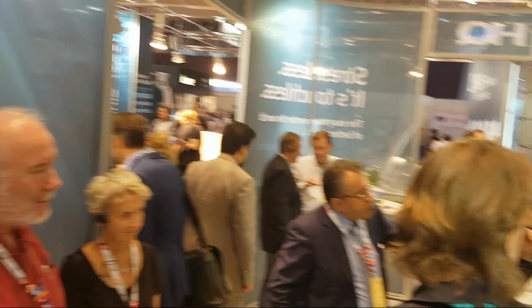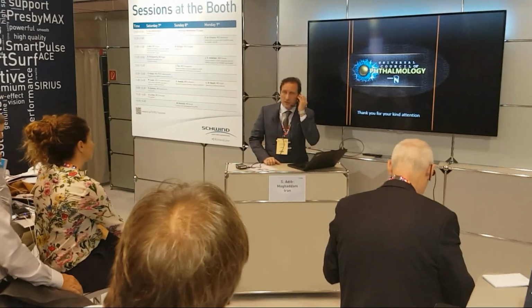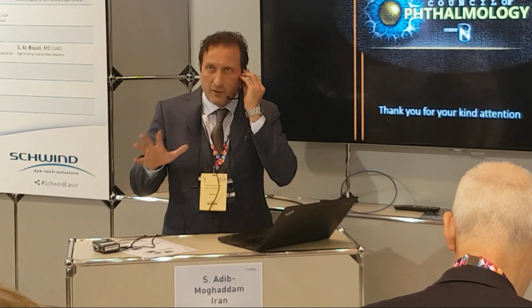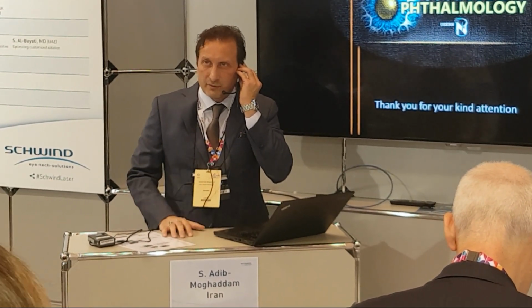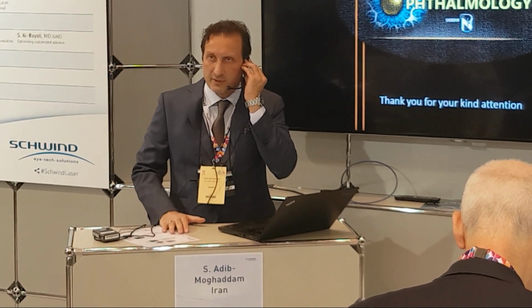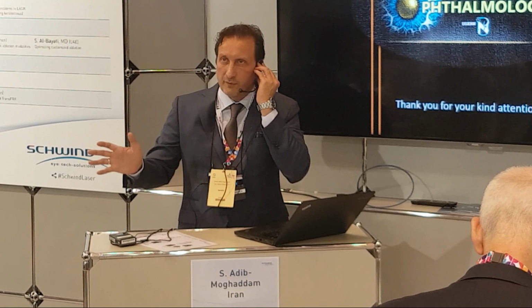What percentage of your TransPRKs are topography-guided? All these operations that I mentioned were aberration-free mode. I would like to say that aberration-free mode works on maybe more than 99% of patients at this moment. The challenging cases are different, for example PK or irregular cornea. But for the rest of the people, you can go straightforward to the aberration-free mode.